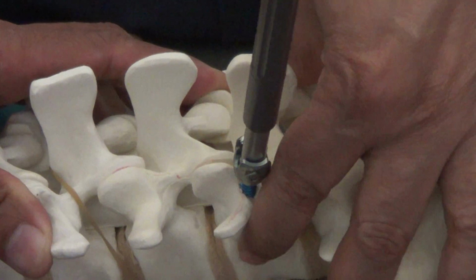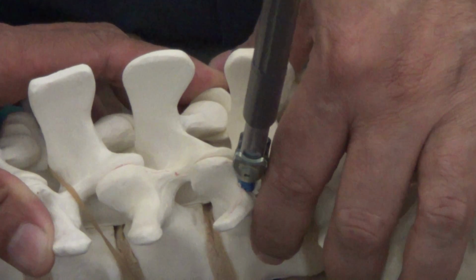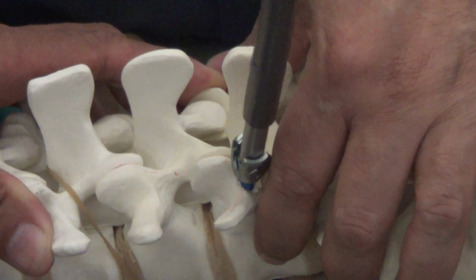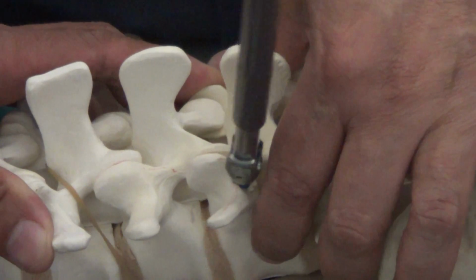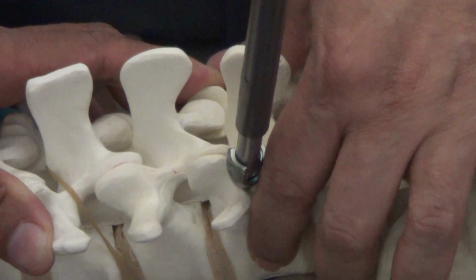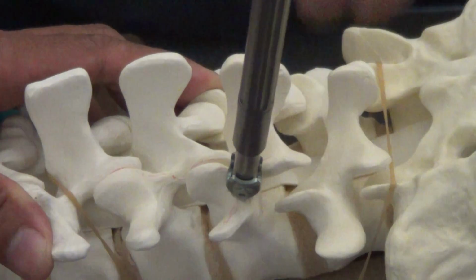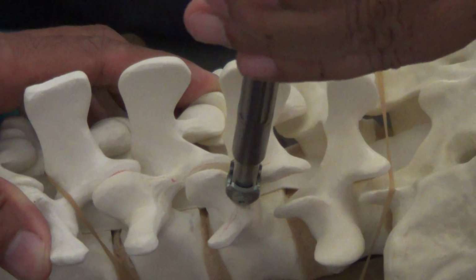Now, the earlier screw design was made by Steffi, where he would go vertically in, and the entry was more medially at the base of the facet. But Roy Camille type of an entry is slightly angulated in. The pull out of the stem of the screw becomes better.